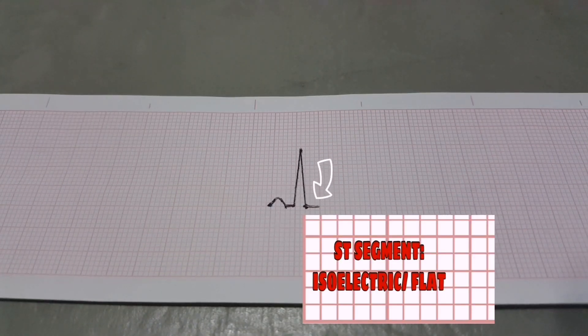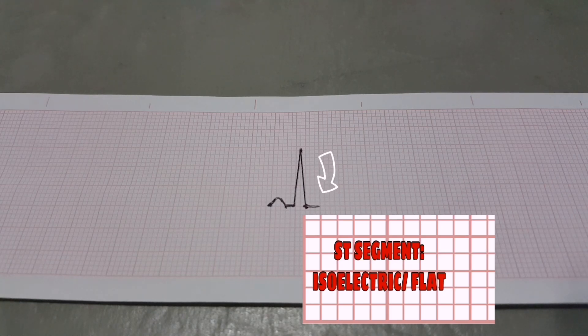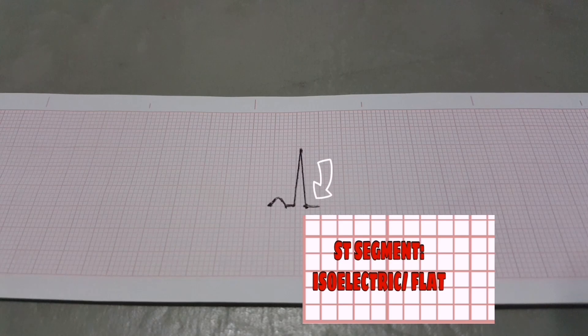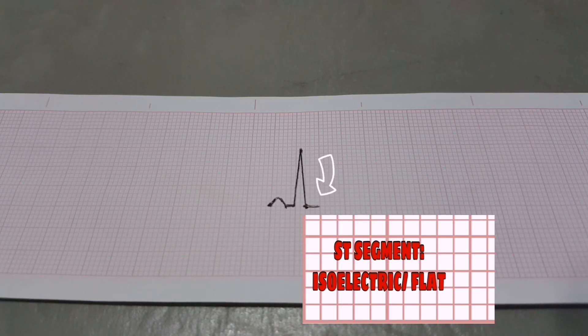The isoelectric period, ST segment, following the QRS and ending at the beginning of T-wave is the time at which both ventricles are completely depolarized. This segment roughly corresponds to the plateau phase of the ventricular action potential.